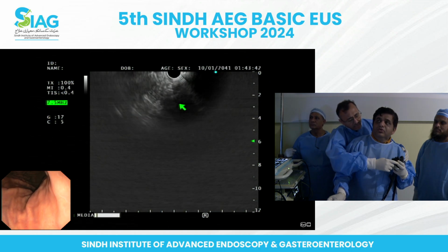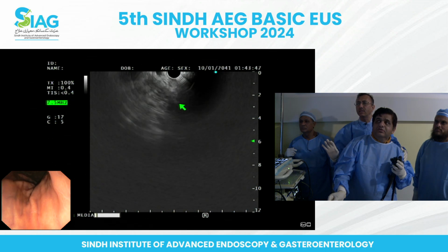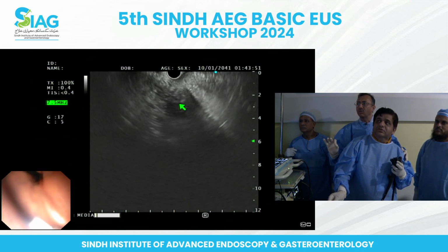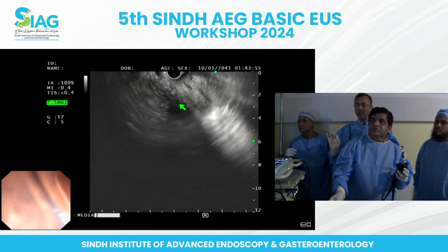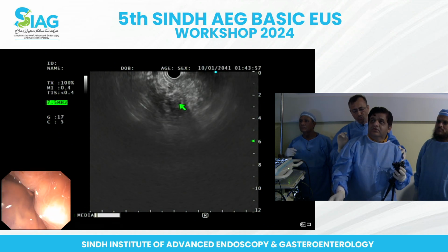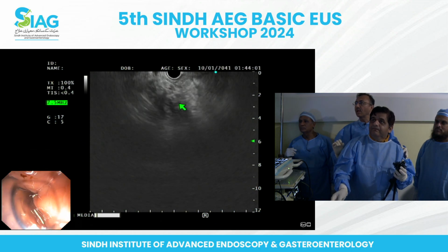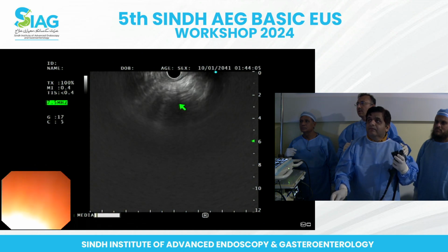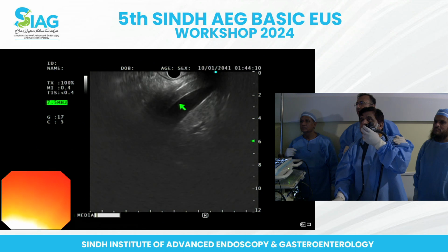Again, I think you're injecting air. No air. You are not supposed to inject the air in the stomach. So suck back the air. Suck back. Don't inject the air. We always have a tendency to inject the air. So we need to learn not to inject the air. So keep sucking the air. So you have lost, so you need to come back to the previous position. A practice of this thing few times and you will be good with that.